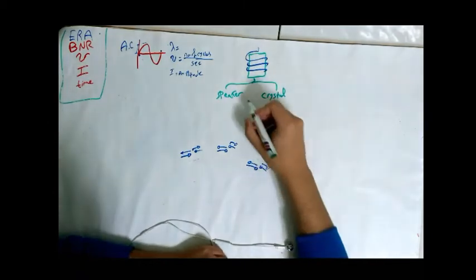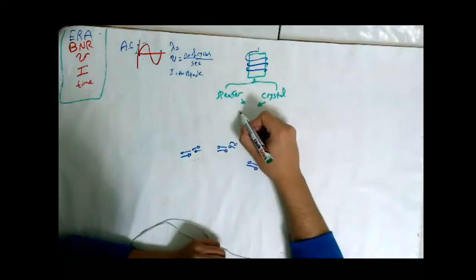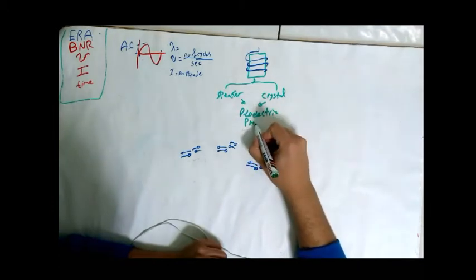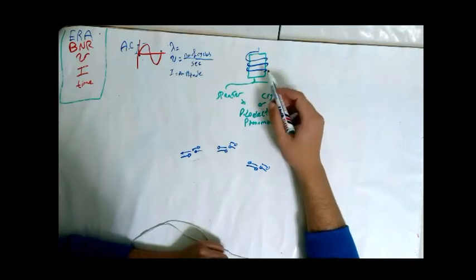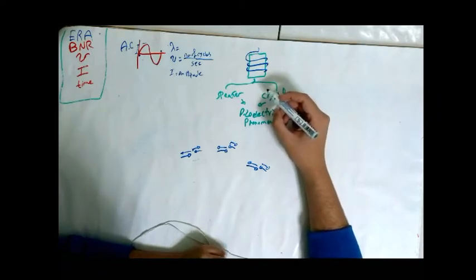Most of these materials have a common characteristic, which is the piezoelectric phenomenon. It means the ability of the material to change its shape or vibrate when alternating current passes around it or through it, and vice versa. It is the ability of the material to produce alternating current when it is vibrated or changes its shape.